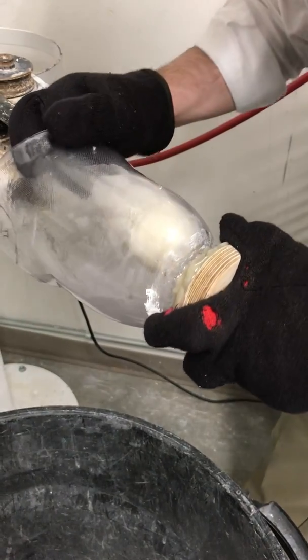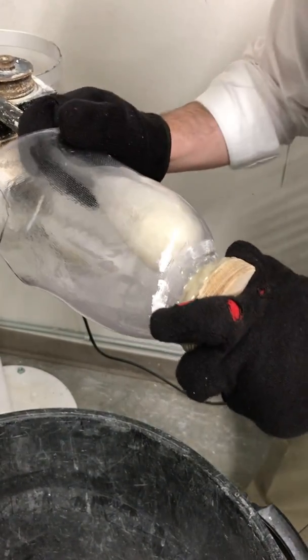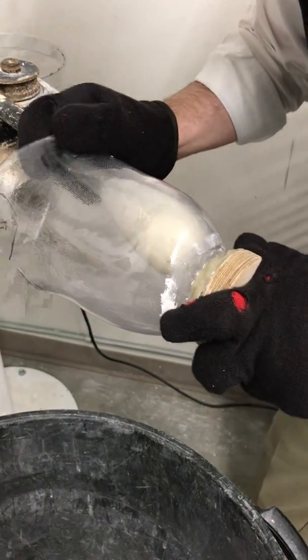We just come in with this tool and we can blow it out very easily. Just kind of move it around and get the shape that you're looking for.